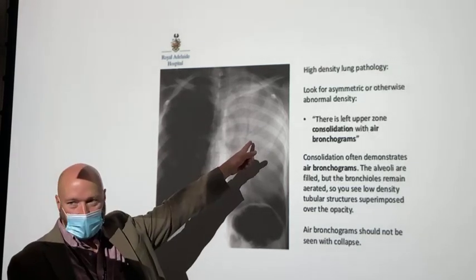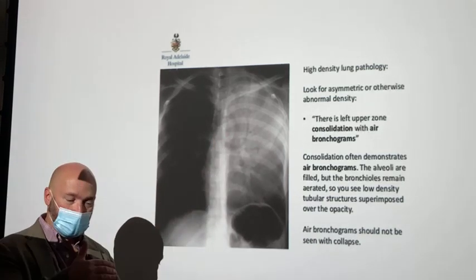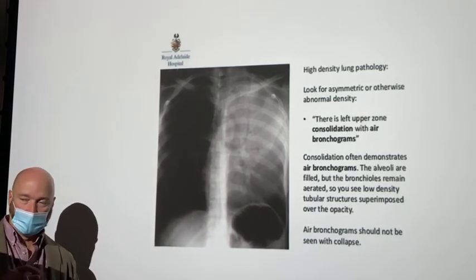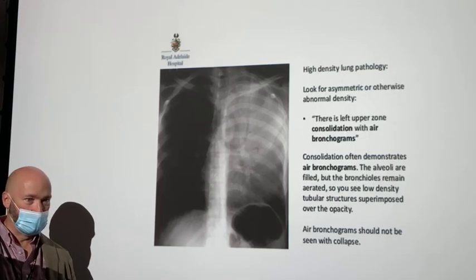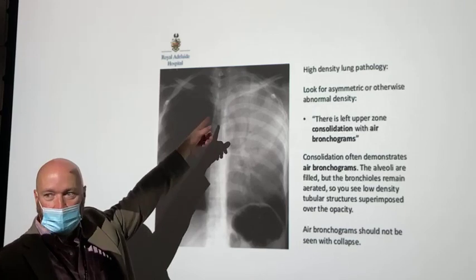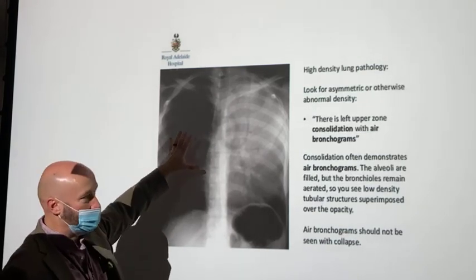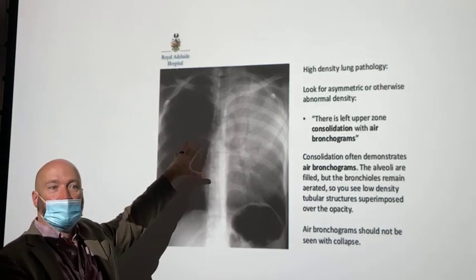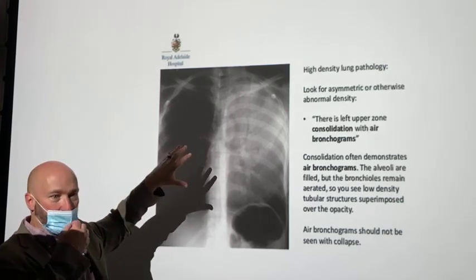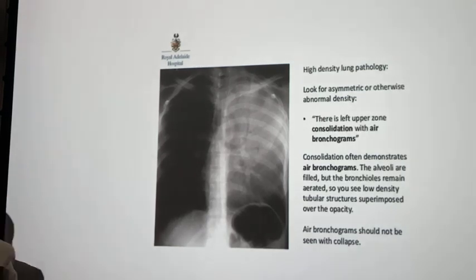One, turn that photocell off. Two is, those little buttons on your control panel that say +1, -1, things like that. Well, the +1 would increase the density even further. So what you're trying to do with the -1 is to remove some of that density. So the -1 removes radiographic density, lowers your technique. Okay?